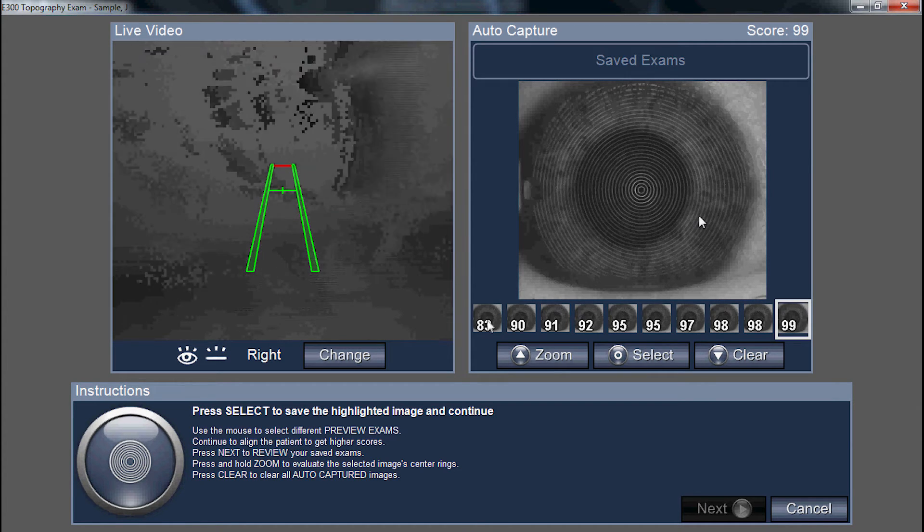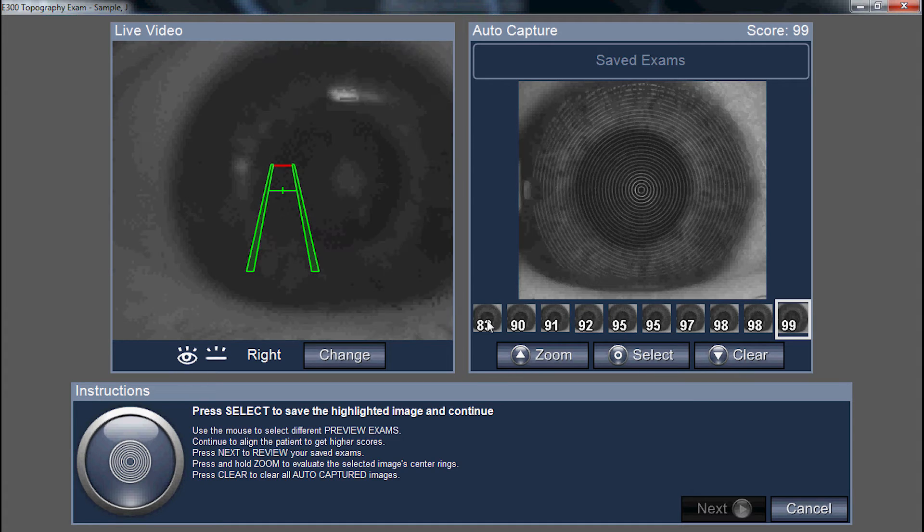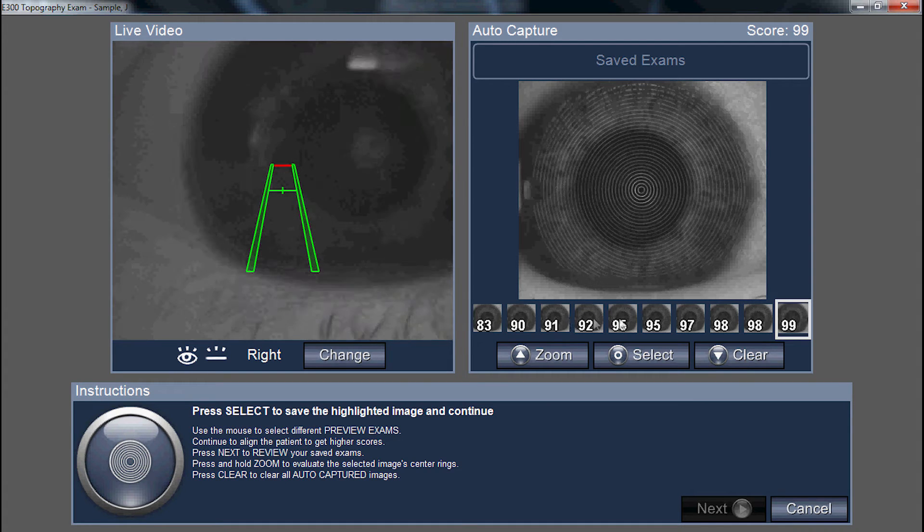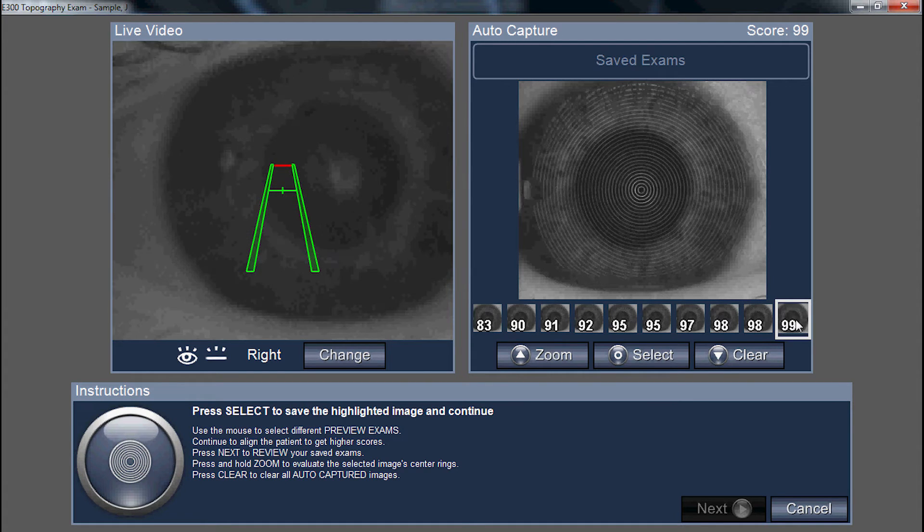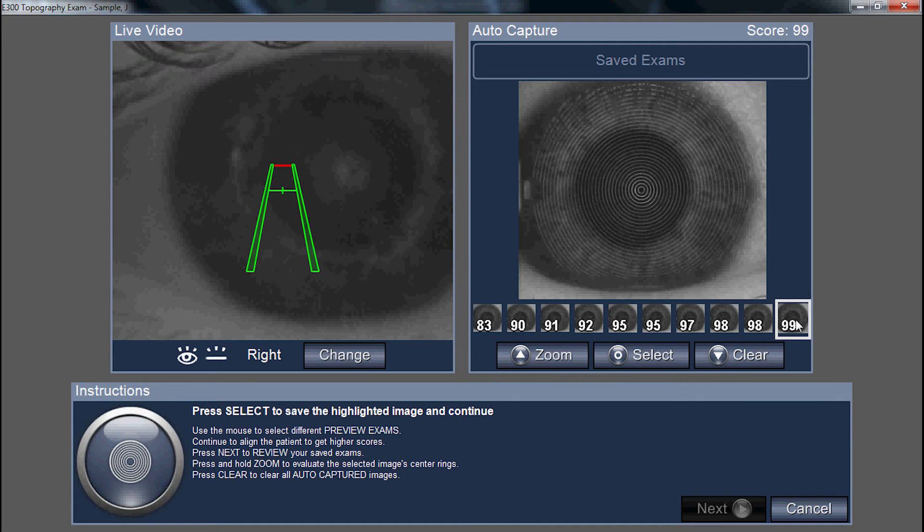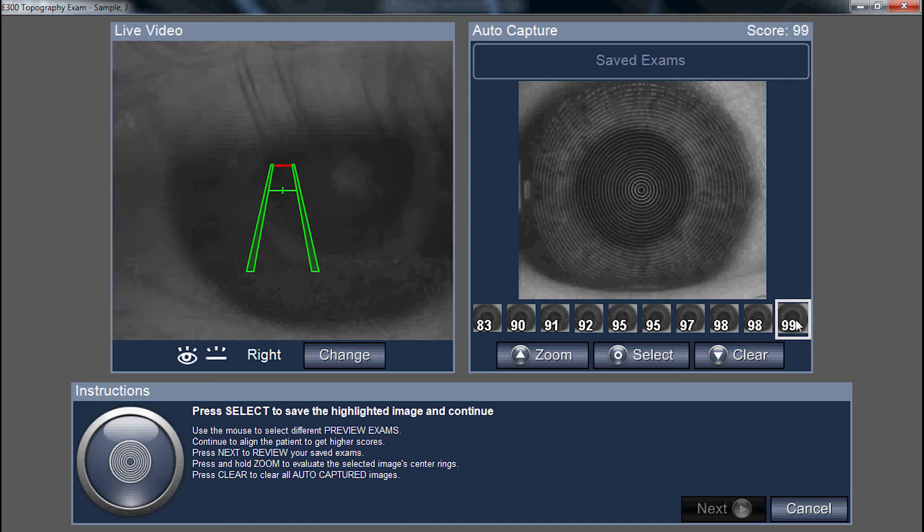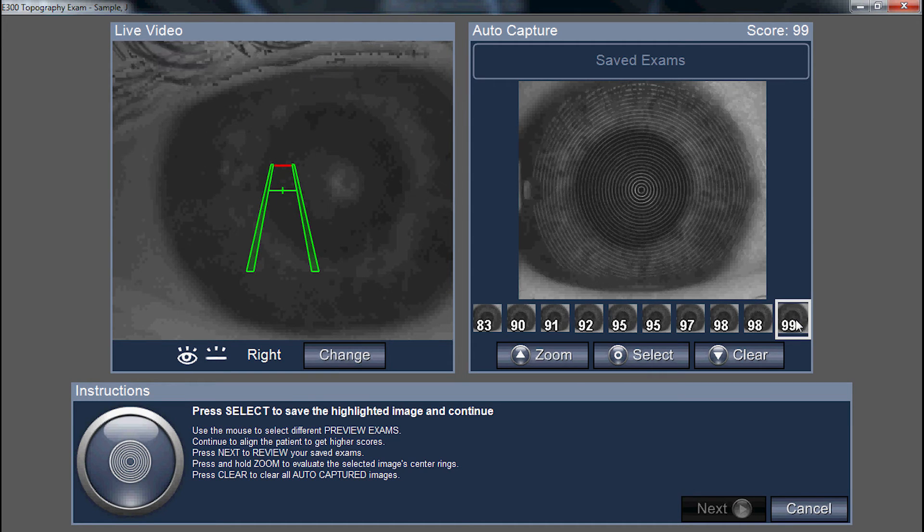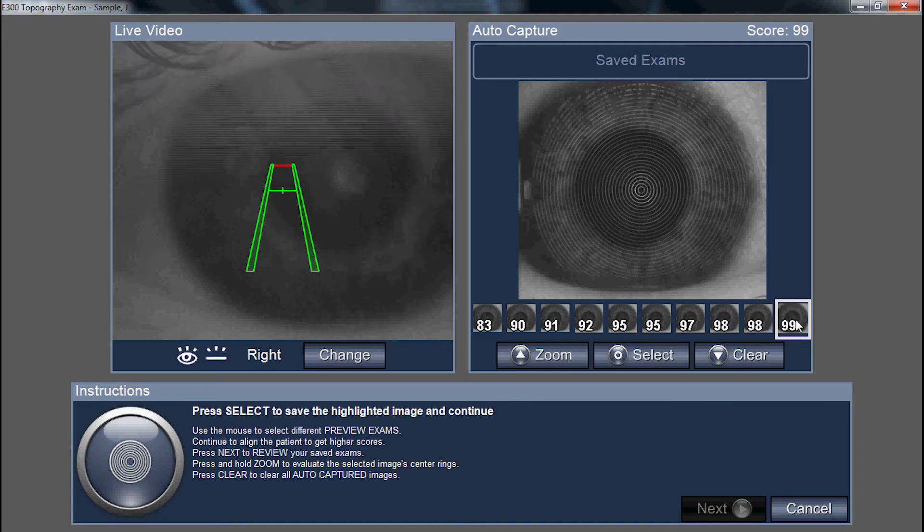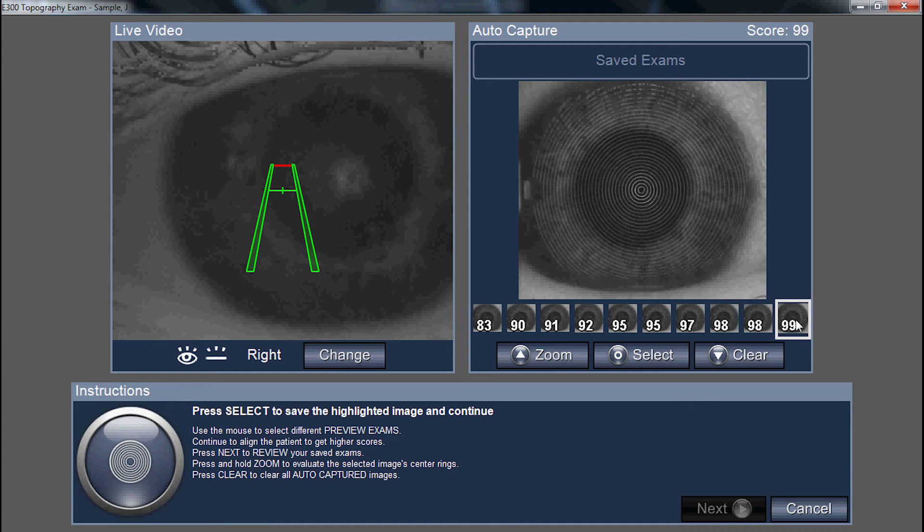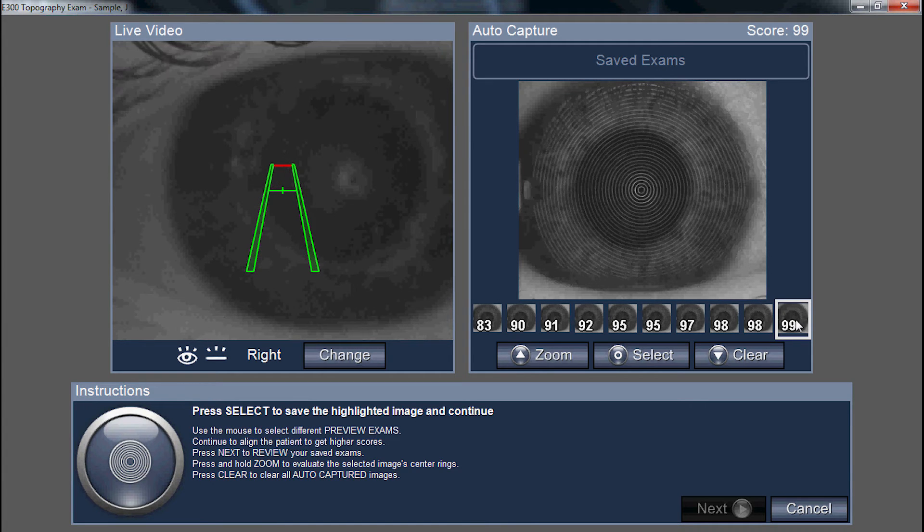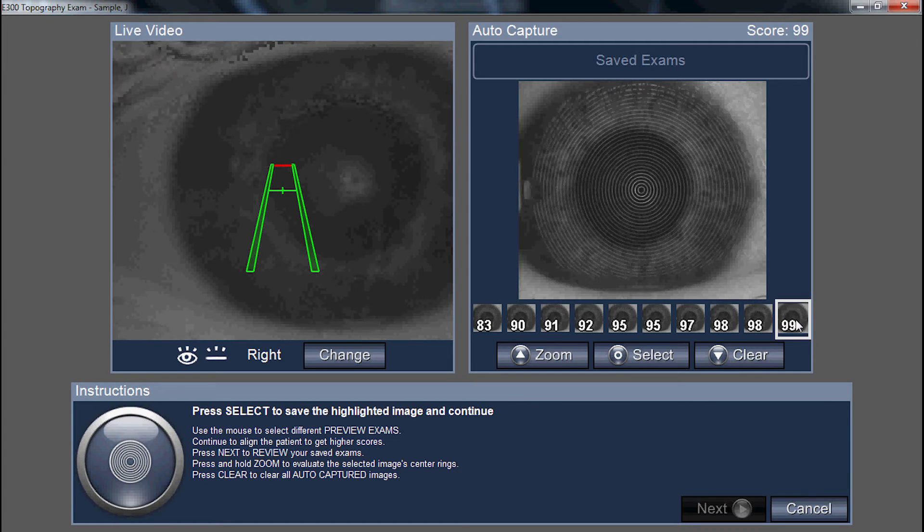You notice we have captures from 83% confidence all the way up to 99% confidence. Your rightmost image will always be your best, at least in terms of centration, light reflection, and the steadiness of the user at the time of capture. This indicates that we have a good photo, but it doesn't indicate that we have smooth and even tear film.